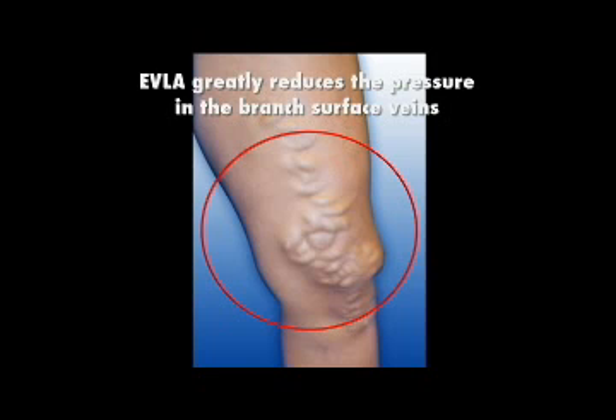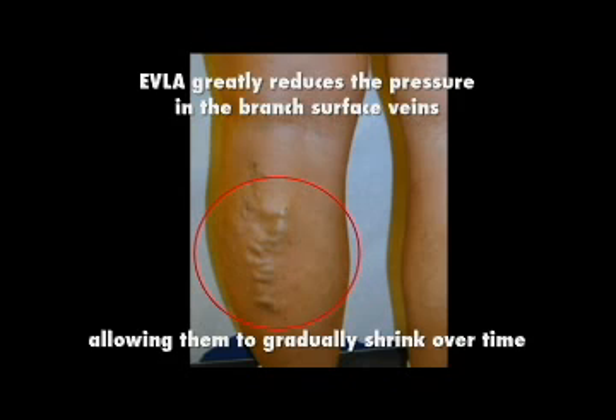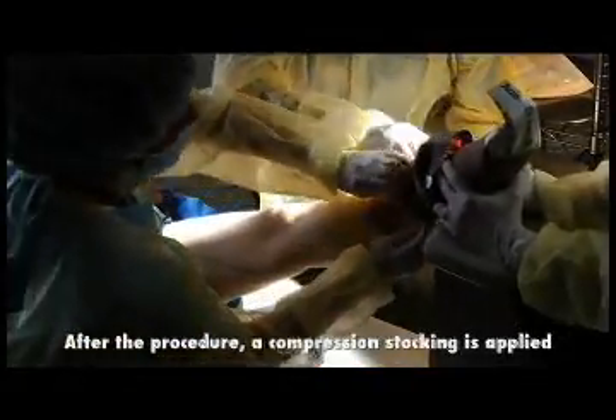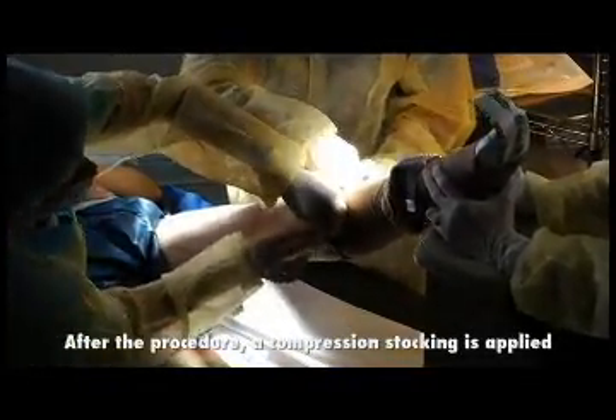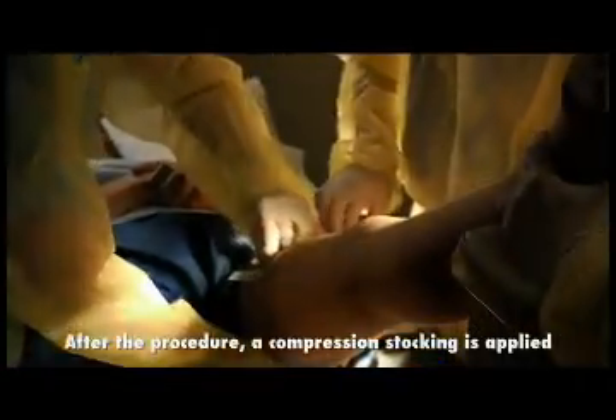EVLA greatly reduces the pressure in the branch surface veins, allowing them to gradually shrink over time. The entire procedure is painless except for the minor injections — small pinpricks — that anesthetize the vein. After the procedure, a compression stocking is applied and the patient is encouraged to resume their normal activities immediately, to include a lot of walking.